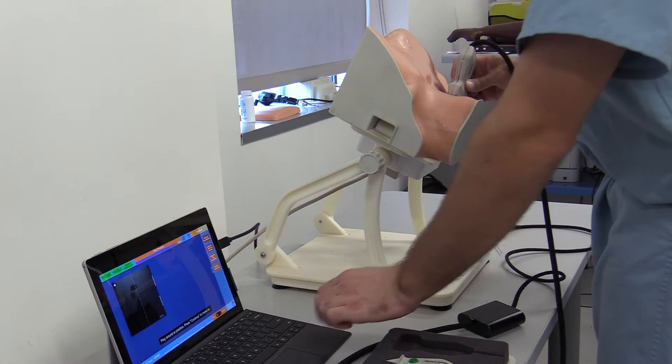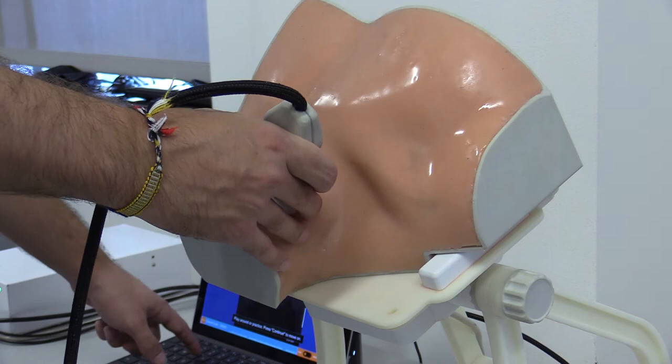The simulated ultrasound images are generated in real-time according to the position, orientation, and applied pressure of a simulated physical probe that is tracked in space. Markers show depth in centimeter increments.